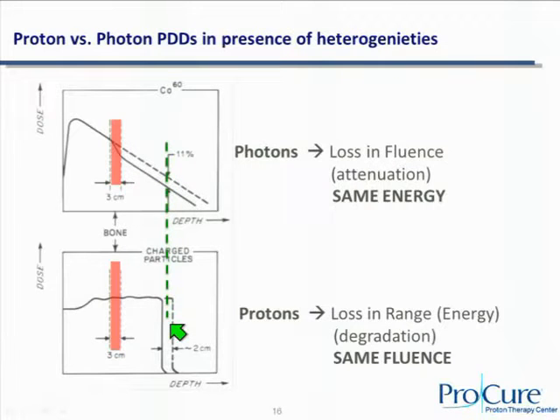There's no dose delivery. So we have to be very careful about what we do in the beam path. Even when you do QA, the wall of your QA device, or a container like a water tank, has to be accounted for, because it pulls back the beam by whatever water equivalent depth it has in that direction.